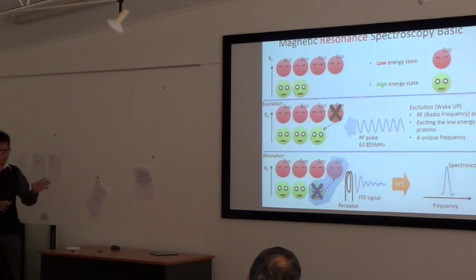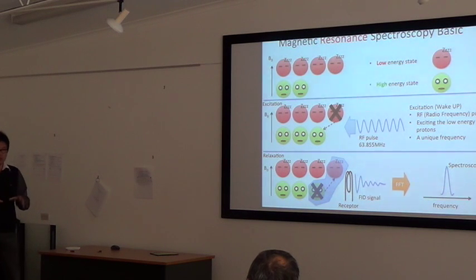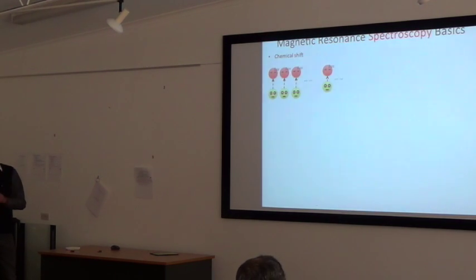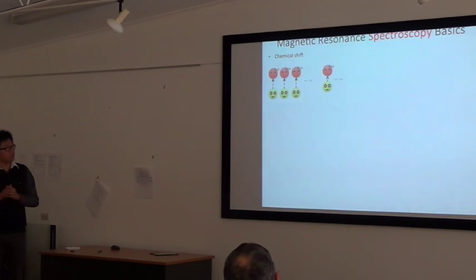So then when we talk about these protons, to give you a rough idea, there are only parts per million of all the protons in the tissue, but it still ends up with billions of billions of protons within a tiny little part of the tissue. Okay, so now we finally come to spectroscopy. So how do we get the spectroscopy?